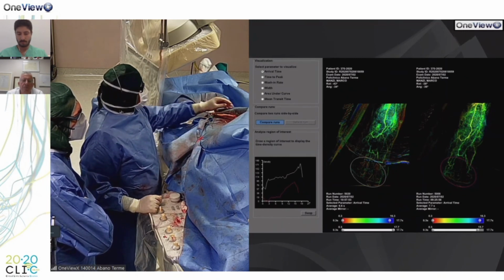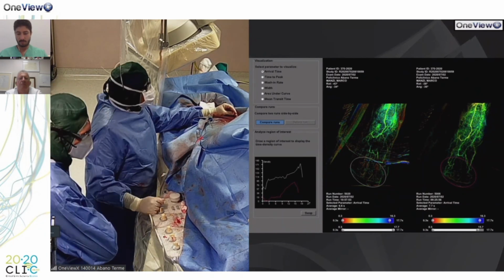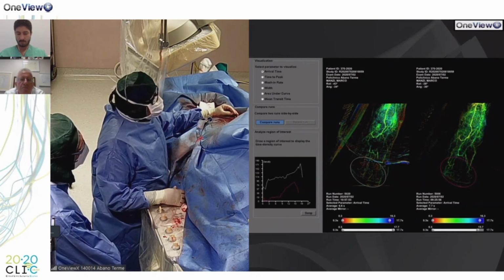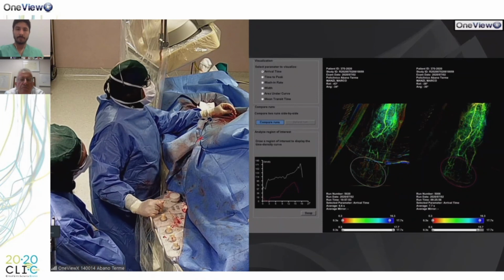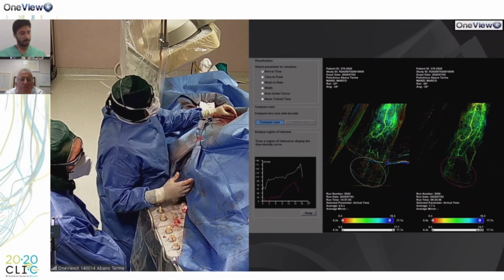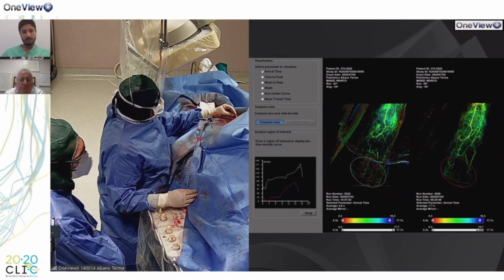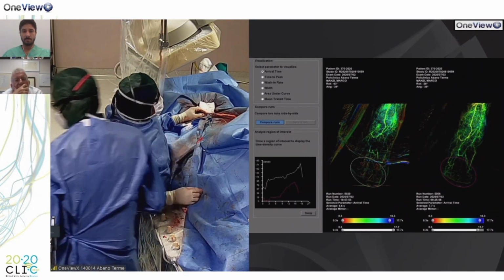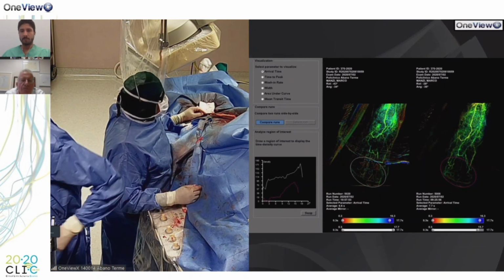We will complete the procedure with the Ranger drug-eluting balloon deployment in the anterior tibial, and I will try to complete the recanalization of the posterior, arriving, I hope, in a lateral plantar artery to improve much more the flow in the forefoot for this patient, because this patient is scheduled for a first toe amputation the next day. So we will try to do our best.